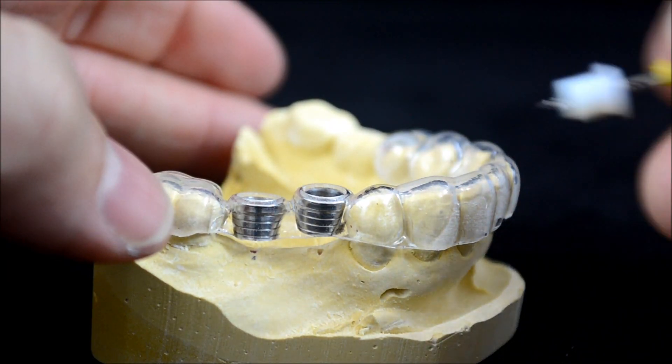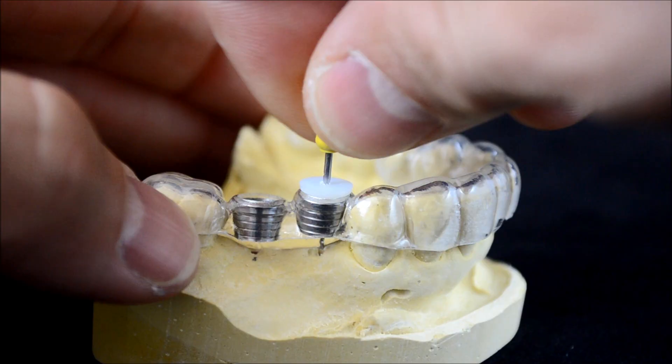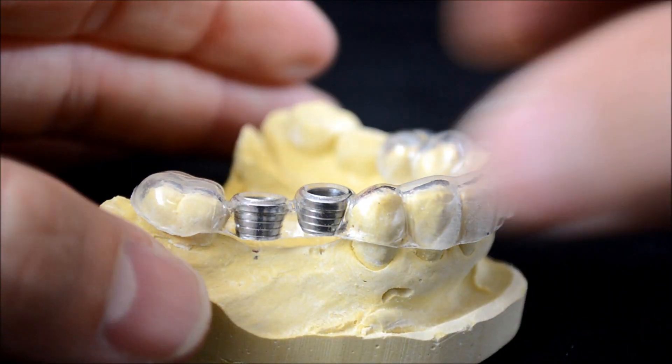First, place the tube guide onto the dentition, then create a bleeding point by using an endo file with an insert we provide to guide it through the tube. You may also use your pilot drill and corresponding drill stop here.